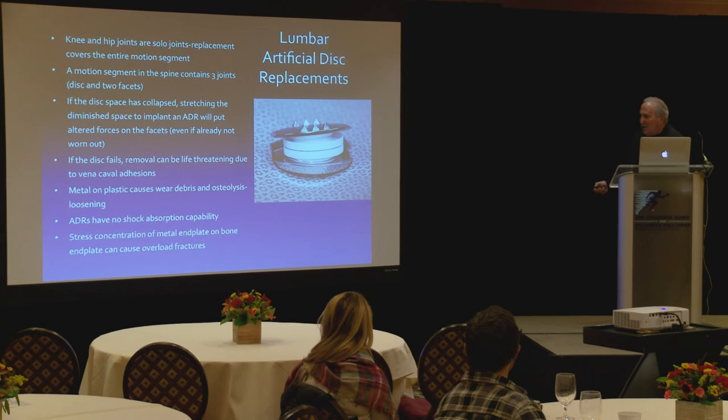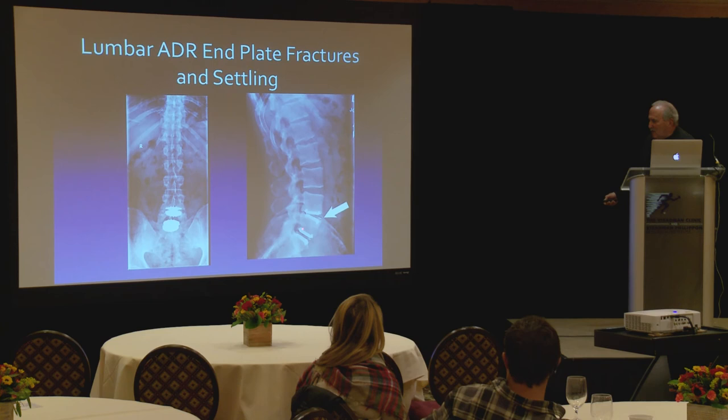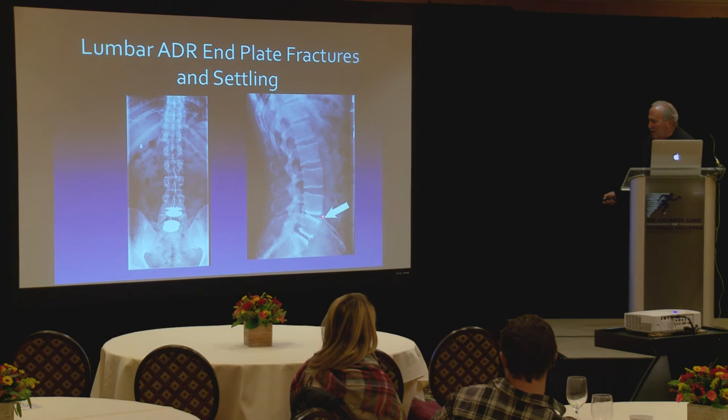So ADRs fail. This is a guy who was a Marine. And you can see, do you see the end plate here and how it's fallen into the vertebral body? So these things have to withstand impact. And after a while, this thing failed and he was miserably painful. And you can't go back in the front and open it up and get it out because the adhesions to the vena cava, again, can kill him as we do the approach.